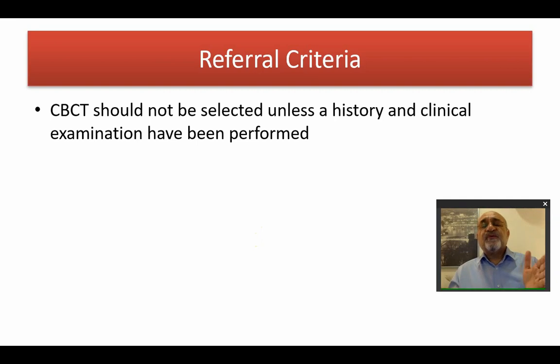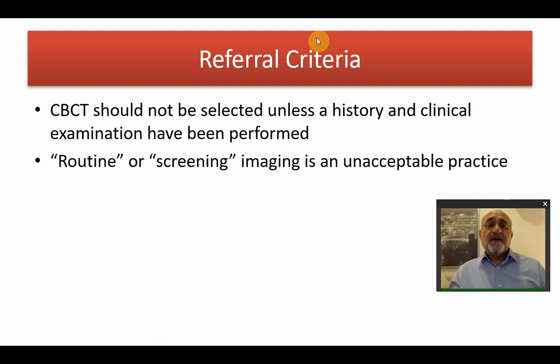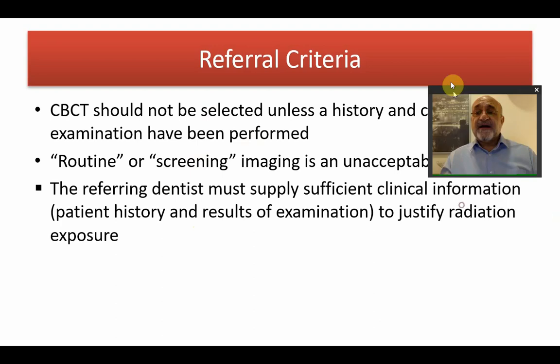This should always be preceded by proper history taking and then clinical examination. If you feel that the clinical examination and the history taking were not enough to come up with a proper diagnosis, then you refer your patient to the CBCT. Routine or screening of the patient is unacceptable practice.